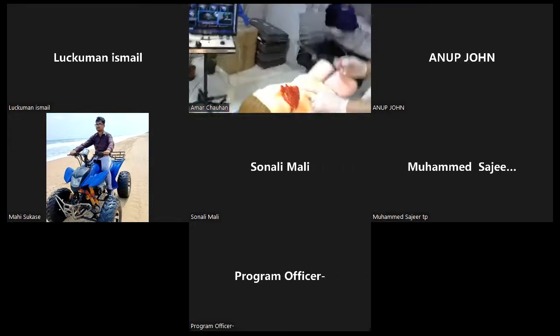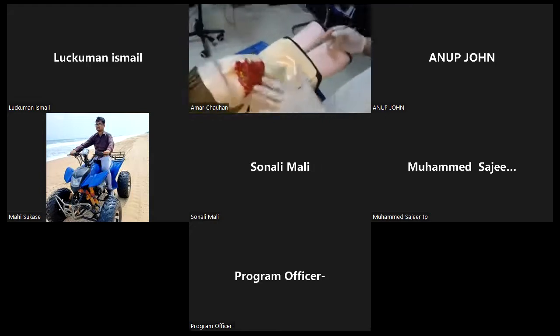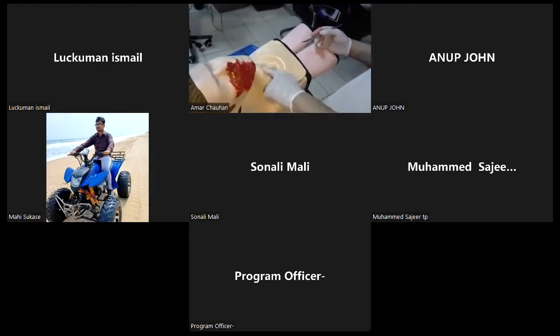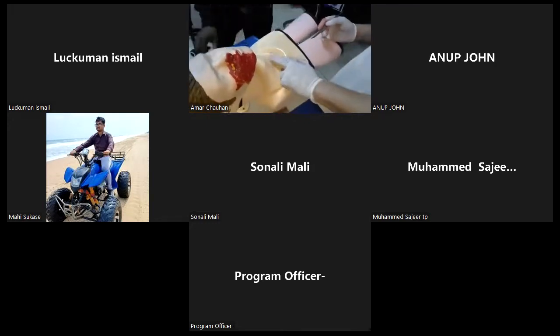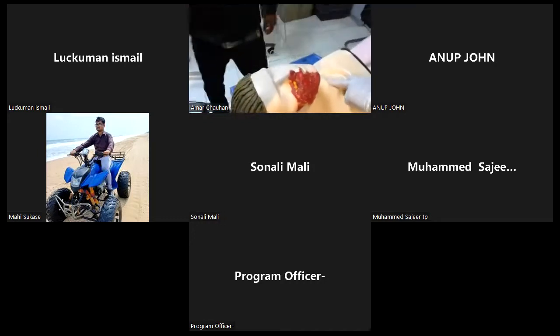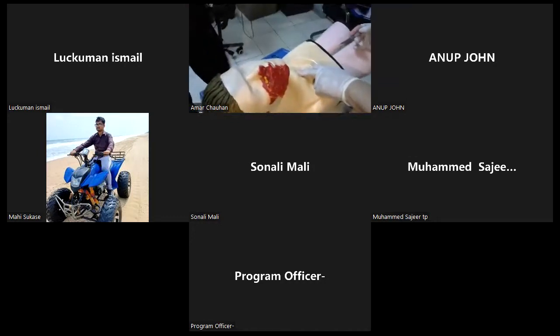So this is our surgical cric mannequin. As the scenario suggests, this is a difficult intubation and you can't even put the mask on. So I will demonstrate the technique for doing surgical cric.